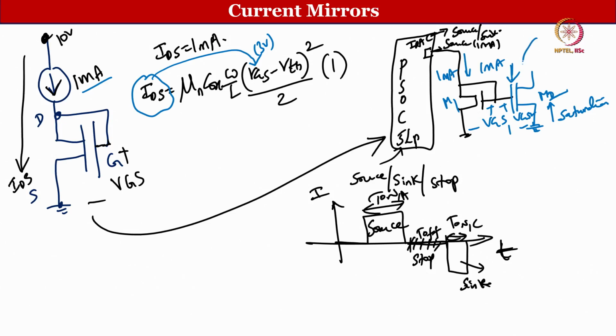So, plus 10 volt, and this is where the load comes here, are you getting it, right. So, if you pump 1 milliampere, you will get 1 milliampere. Of course, there will be some non-linearities, that also can be addressed using different current mirror configurations, or slight non-linearity will be accepted as long as you maintain this charge neutrality, right.